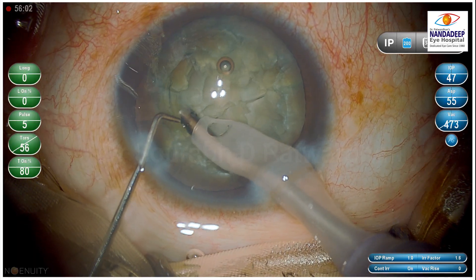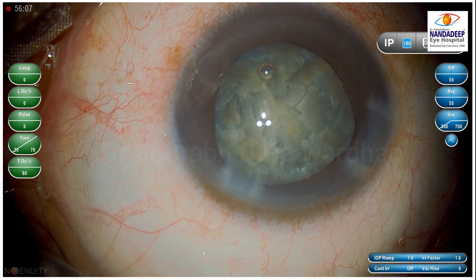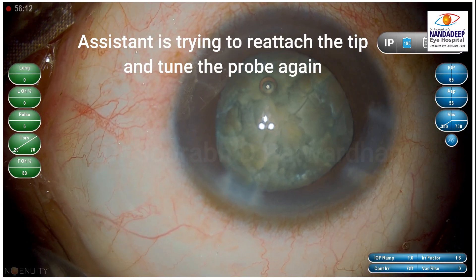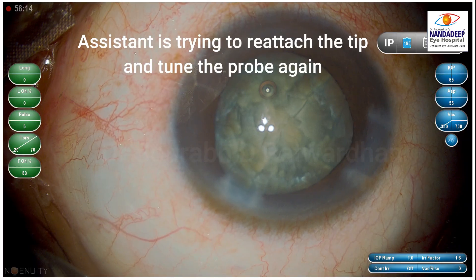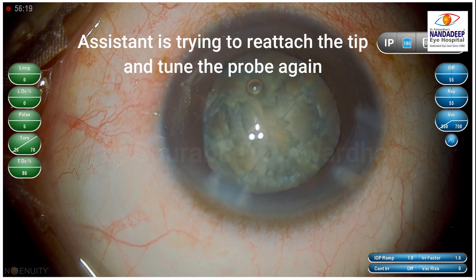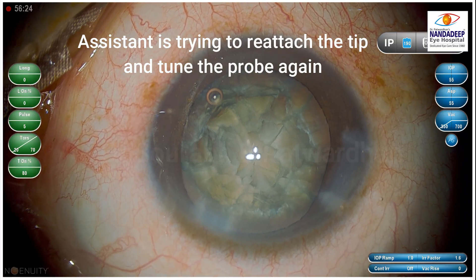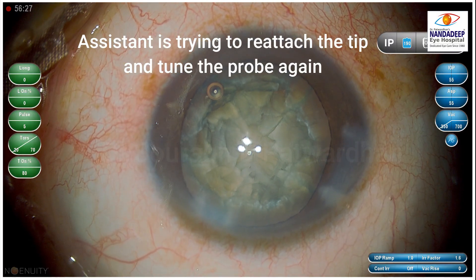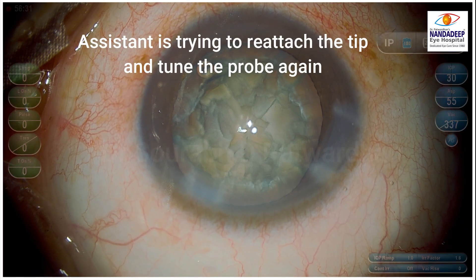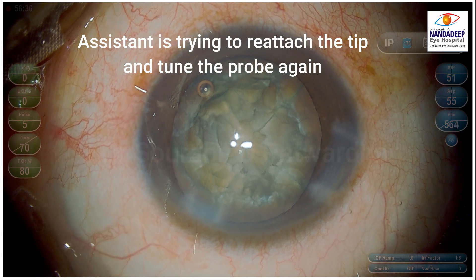What I find is that when surgeons do not realize this in time, they might go on giving more and more phaco. Here the assistant is trying to reattach the tip and tune the probe again, thinking there might be an issue with the fitting of the phaco tip causing the vacuum not to build. Once the tuning and reattaching is done, the assistant will hand me the probe again.